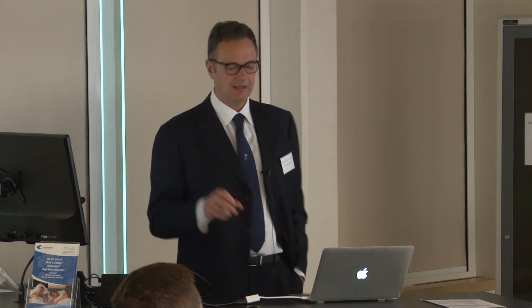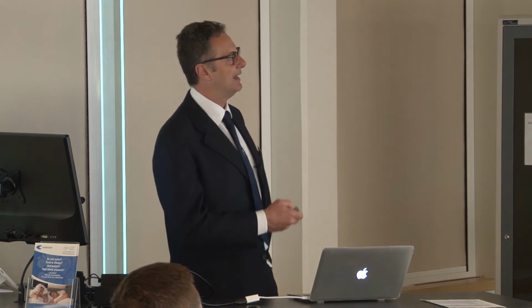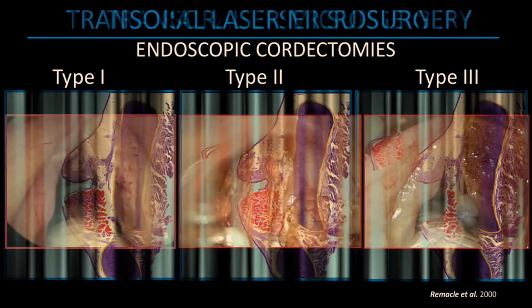That doesn't make sense, because if you just make a punch biopsy and you have the histology of carcinoma or a severe dysplasia, you are obliged to make a re-resection deeper than in type 1 and 2. So this is our routine use of excisional biopsy. I will give you some examples.